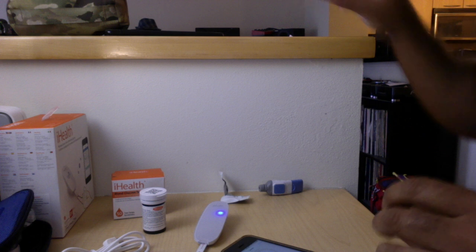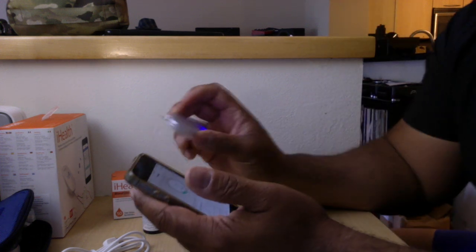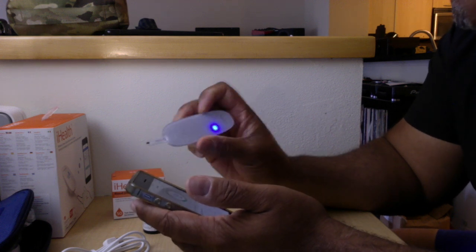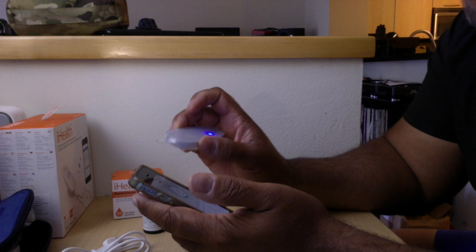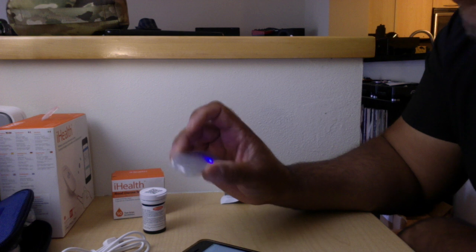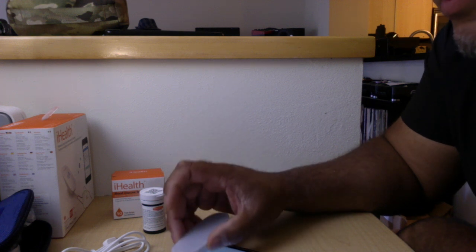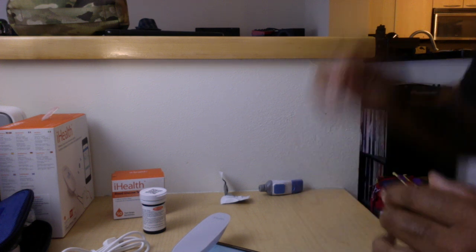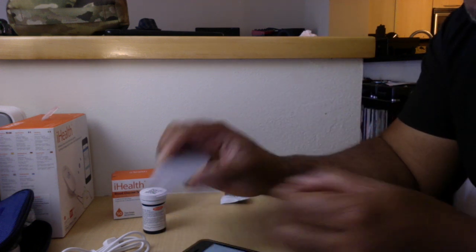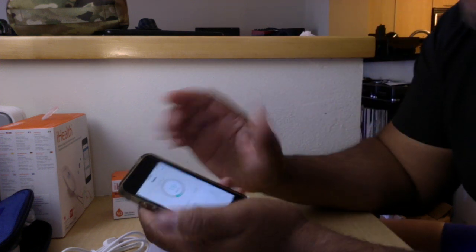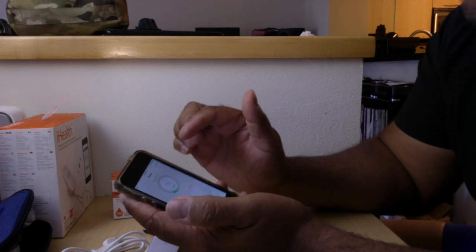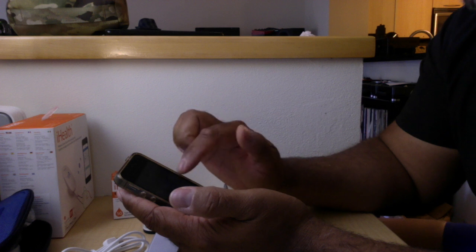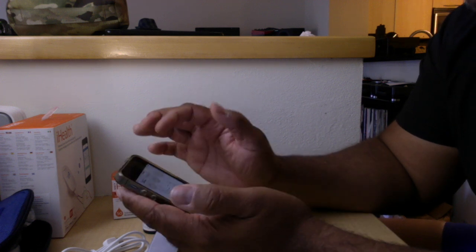I really haven't eaten much today, and one thing I will say about this device is that it measures whole blood instead of plasma. The AccuCheck actually does plasma. Whole blood is more of an older way to measure blood sugar and apparently it's not the same as what they use in the lab. So I've read the numbers can be anywhere from five to fifteen percent higher for plasma readers than whole blood. So that's something to keep in mind with this number. I'm gonna do some more research and I have another meter coming so I can compare the two, and I'll do another video of that.